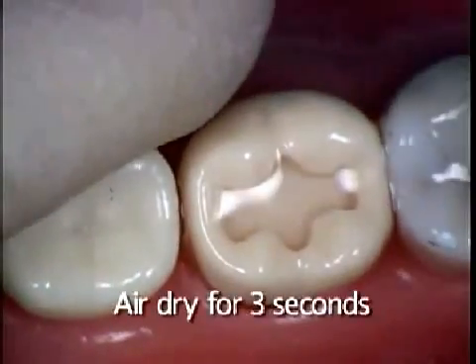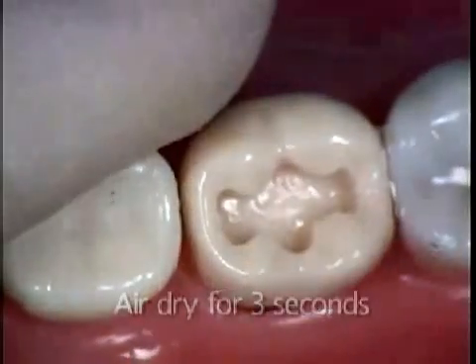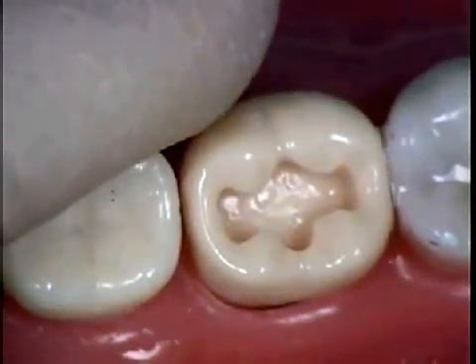You want to then air dry for 3 seconds, and leave the surface slightly moist.